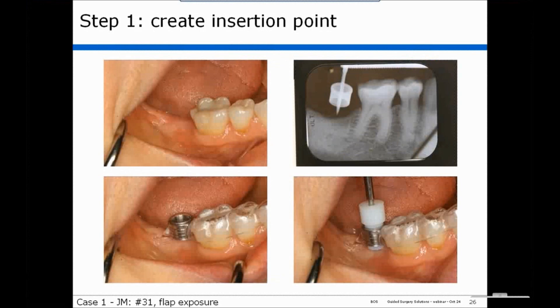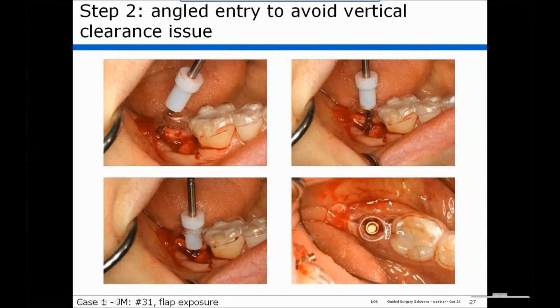Now let's look at the first case clinically — a lower second molar. We placed the spear drill in a plastic insert in the tube guide and took a film to illustrate the trajectory of this implant. We used the tube guide to start; the plastic insert is placed with the spear drill to create a bleeding point, and we created a pilot hole. In this case it was a flap exposure, and importantly, the guide in no way impedes your ability to reflect the flap or to access and see the site.